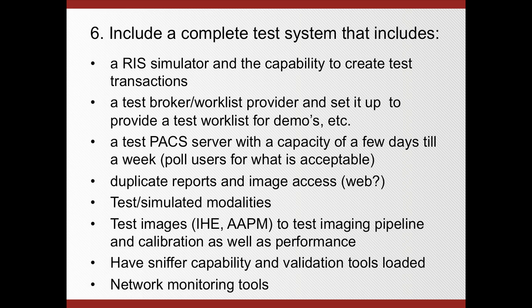Another thing you want to have installed is sniffer capability and network tools and validation tools. A sniffer will allow you to track problems that might not necessarily be reproducible, and you need to be able to go back, let's say, to a certain time period where a certain event occurred, such as a timeout or aborting a transmission, and you want to find out what exactly happened using a sniffer, so you can then go back to the vendors and do some troubleshooting. Validation tools as well and network monitoring tools are very important. If you did not have those available, make sure that you include them now with your next go around.